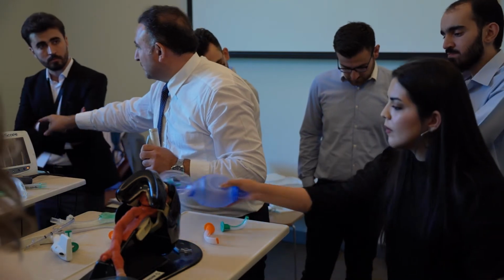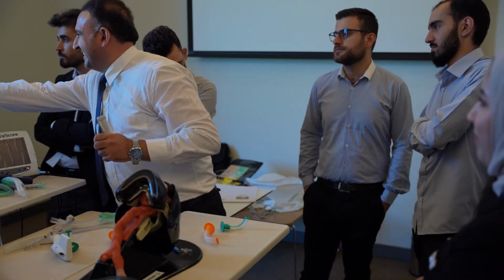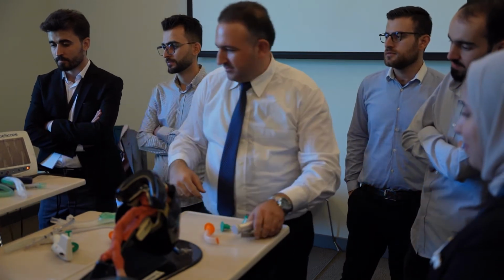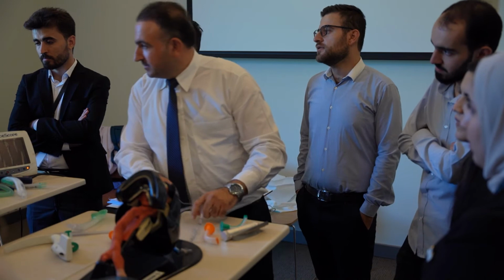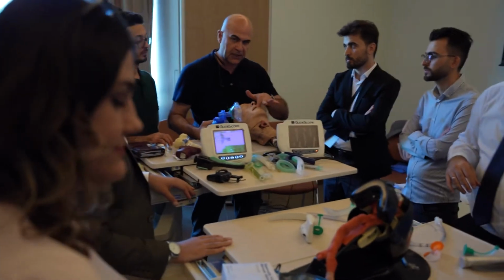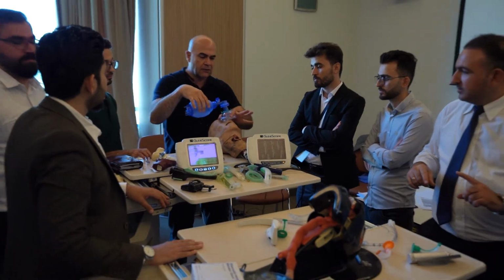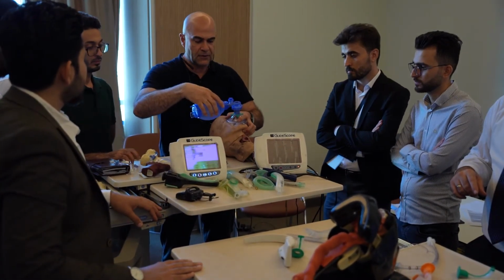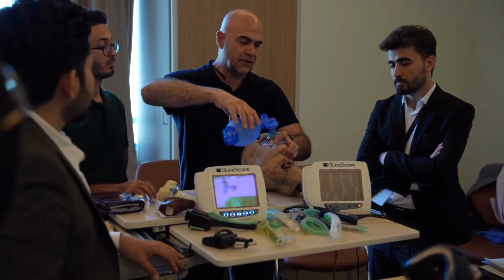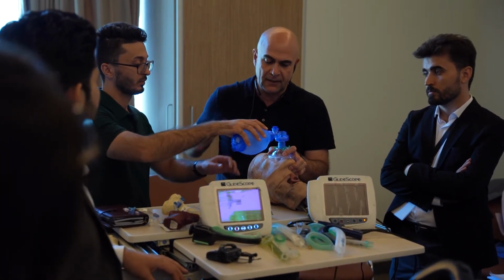This is for ventilation, C and E. I will make a laryngoscopy here for intubation. Now let us show you how you are going to do ambo bagging. You open the mouth, clean the mouth, put in an oropharyngeal airway, and hold the mask like that, C and E. You hold the angle like that, and do inflation. If you are 2 persons to rescue, you ask your colleague to ventilate by ambo bagging.